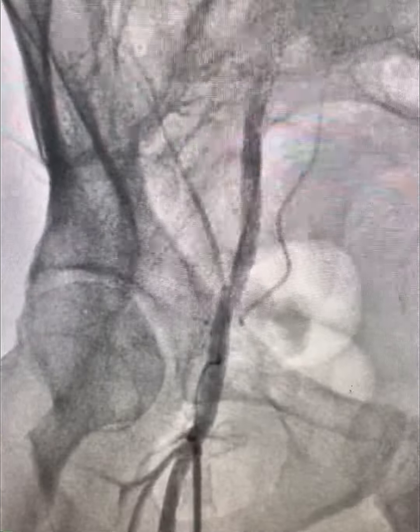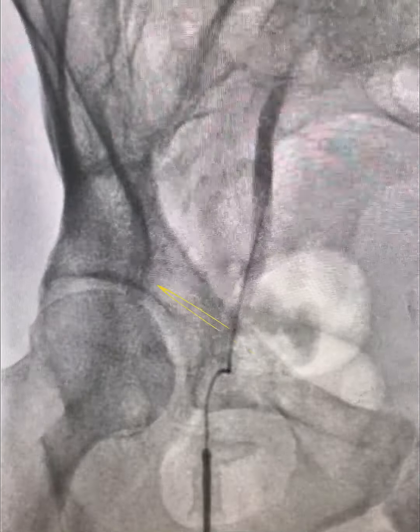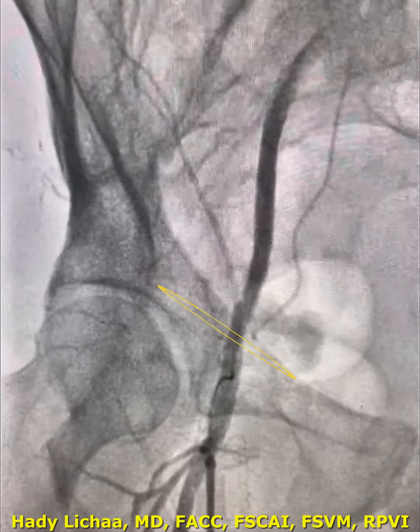When the operator is in the cath lab, this is followed by the mandatory fluoroscopy of the needle wire transition to make sure it's at the mid or lower than the mid-femoral head. And as you see here, the no-stick zone is identified by the nadir of the inferior epigastric artery, and the stick was below it.